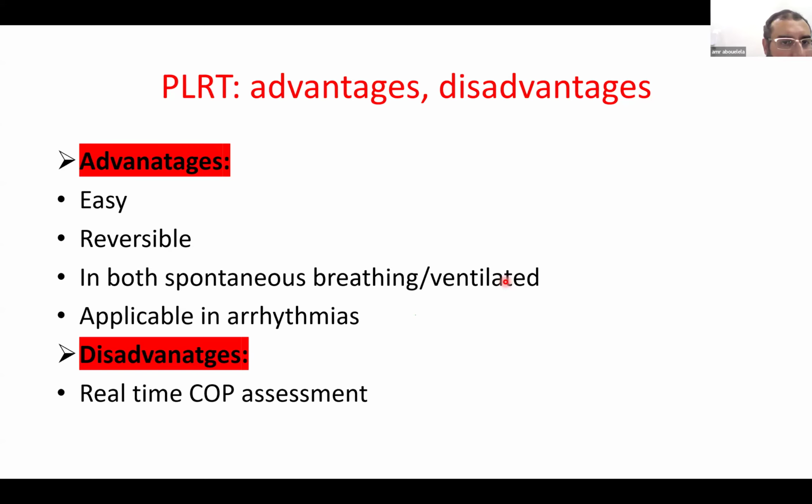So I will ask you a very important question because we are considering different settings. If you don't have a PICO monitor, which is the situation in many of our ICUs, and you also don't have enough scales or an echo machine, you cannot measure the VTI. Is there any simple intervention you can use as a surrogate of the cardiac output without using the PICO and the echo? This is a question for you. If you have any answer, anyone can answer. Any simple tool which can predict the cardiac output?